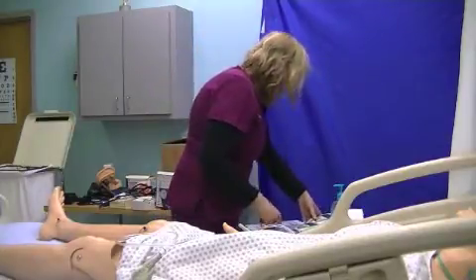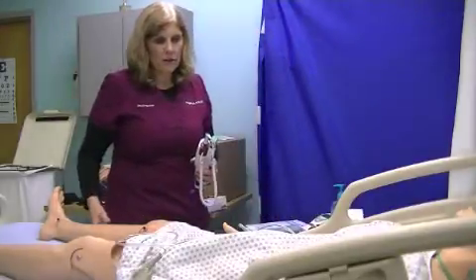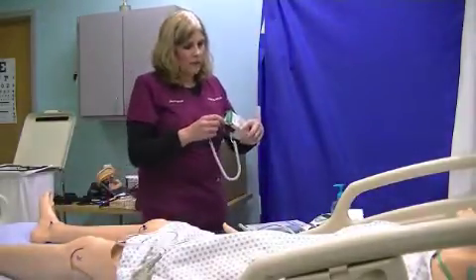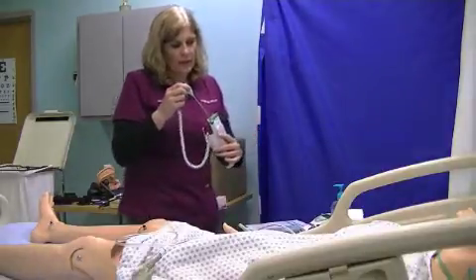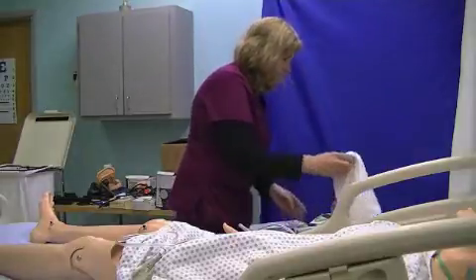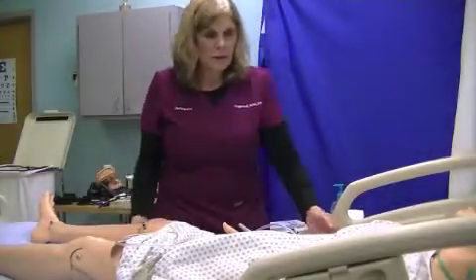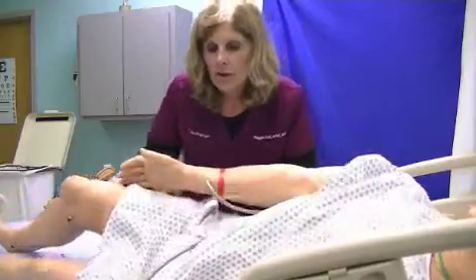The next thing we're going to do is I'm going to show you about a rectal temp. If I'm taking a patient and they're doing a rectal temperature, I'm going to make sure I put the sheath on. I'm going to make sure I have something over the patient. I'm going to have the patient turn over on their side.